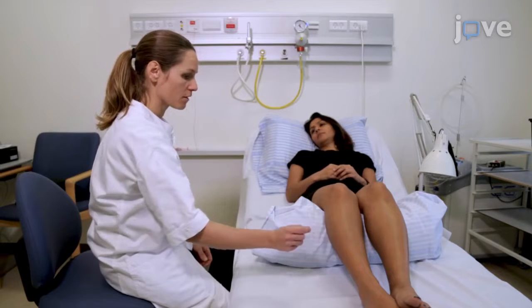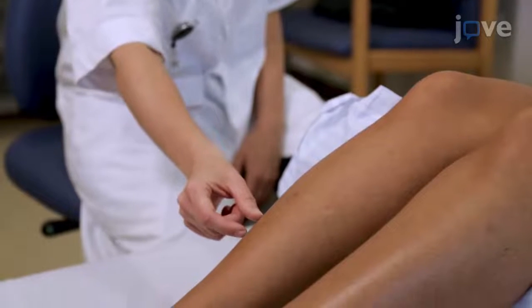Inform the subject about the insertion of two needles in a leg muscle and that the muscle fibers will be stimulated with a weak current.